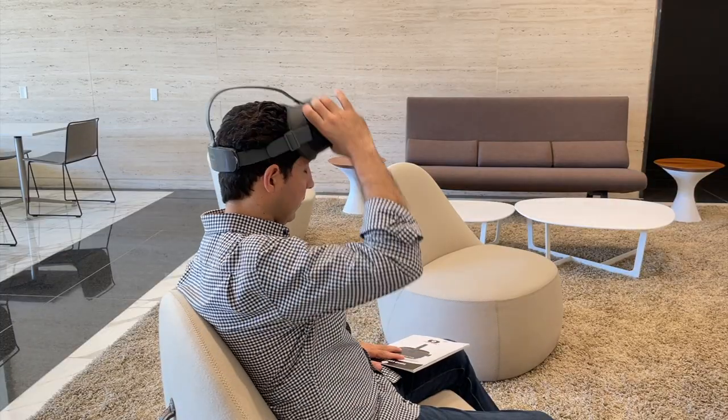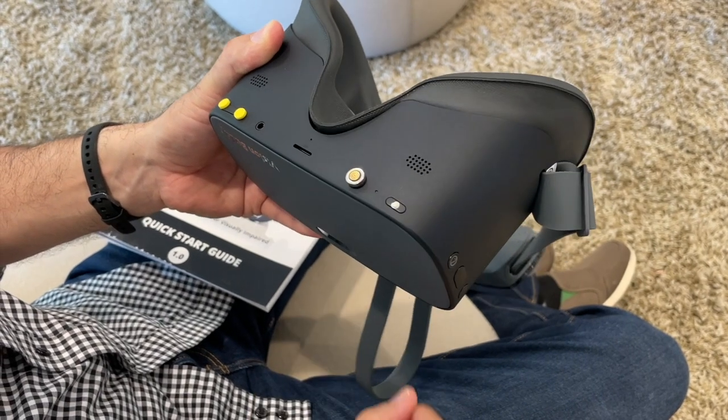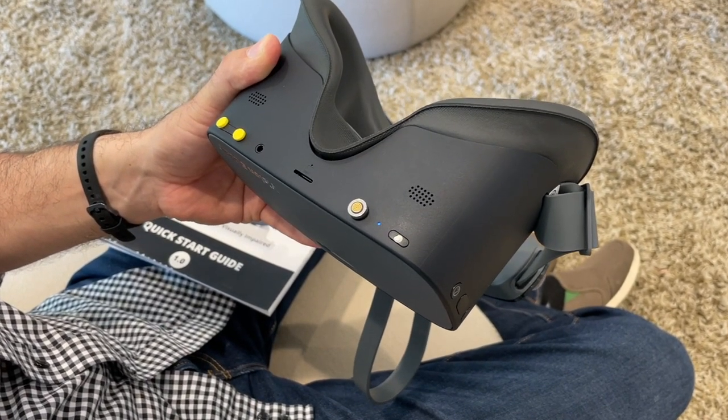Once you are done using your headset, make sure to hold down the power button until the blue light begins to flash, and then safely store your Vision Buddy headset after use.